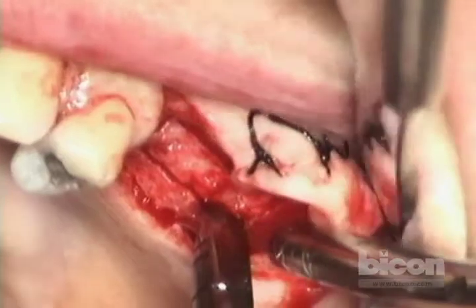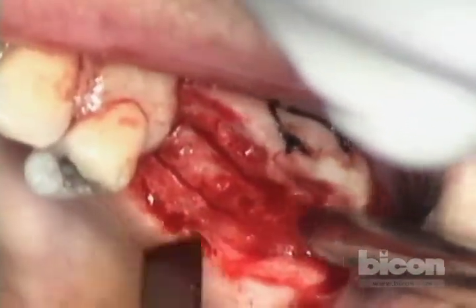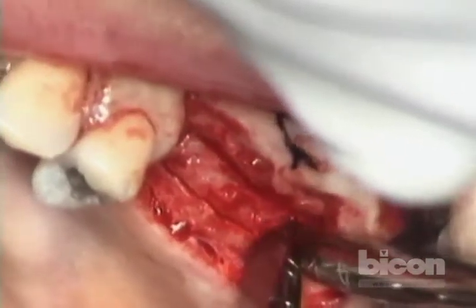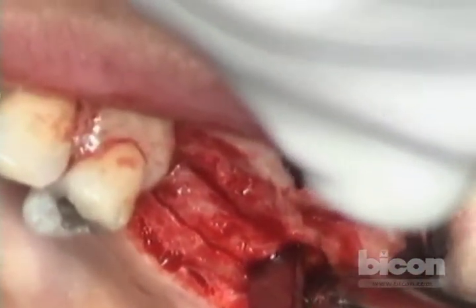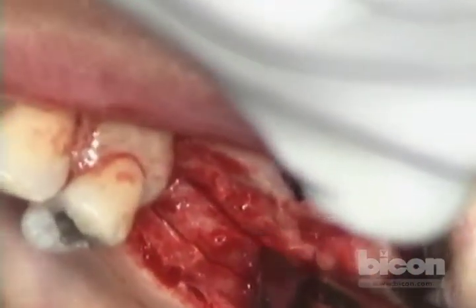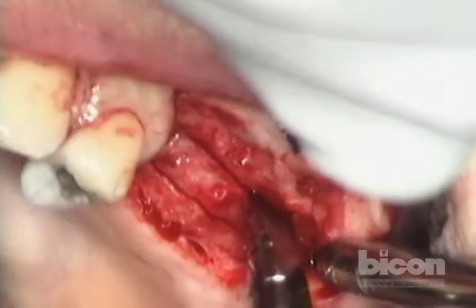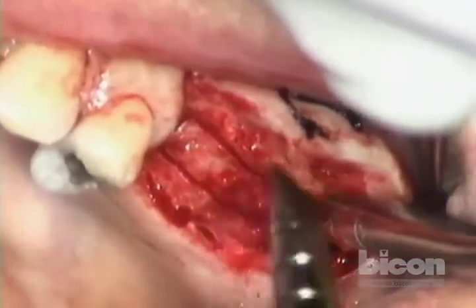We're going to go over it a few times, because the bone is never of uniform thickness. The x-ray gives you one dimension. Even if you have a CT scan, it's still going to depend on where you connect with that bone — it can vary by within a millimeter, where you'll have a much thicker or harder area which a CT will not control for.